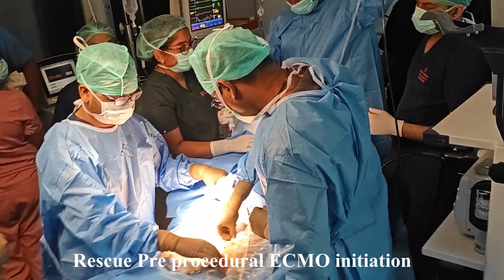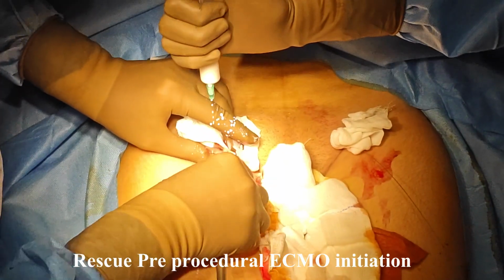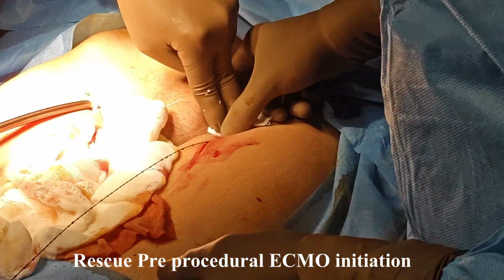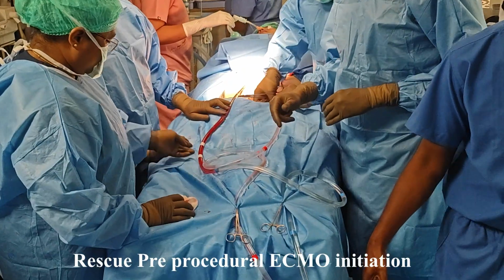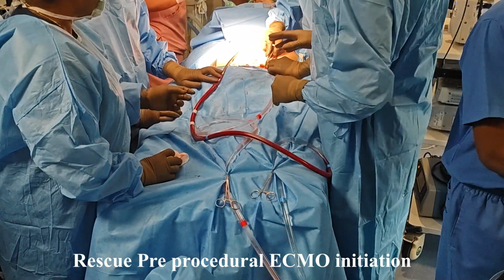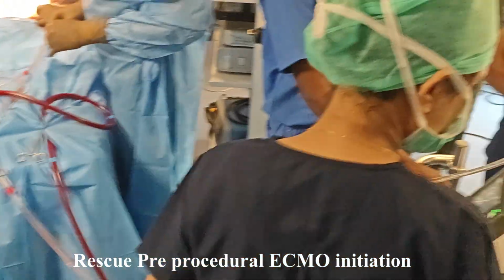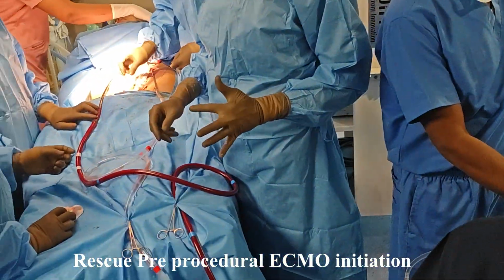Now, once the patient is able to lie down with the help of mechanical ventilation, venovenous ECMO is initiated through the bilateral femoral veins. The guide wire is passed, then the dilator is placed, and then the cannula is inserted, and you can see the gush of blood coming through the cannula, which then goes into the membrane oxygenator, and then the oxygenated blood comes back through the cannula into the femoral vein.